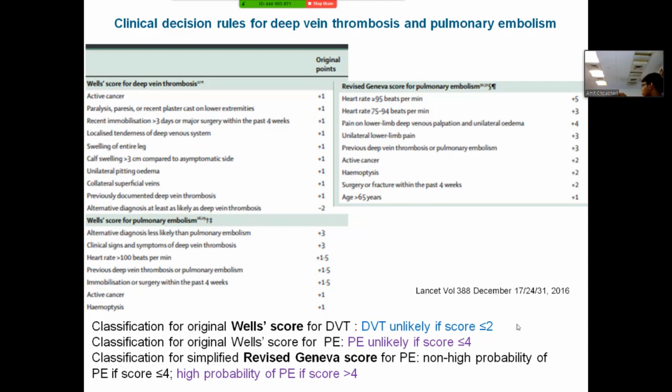That's how you differentiate whether it's venous or arterial. In arterial, you will see a line that is coming down and again coming up, so that is a triphasic one. The venous one is monophasic, but still because of the respiratory system there is a phasicity, because it is increasing along with the respiration: inspiration, expiration, inspiration. So that phasicity is maintained. If you do Valsalva, there is a complete obliteration of the phasicity. The flow will stop, and suddenly you do the augmentation.